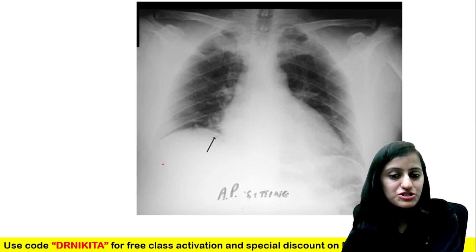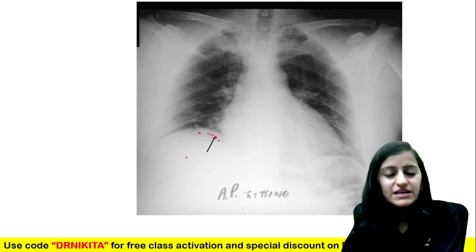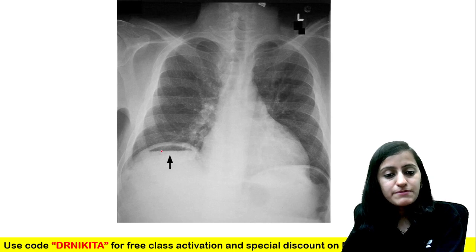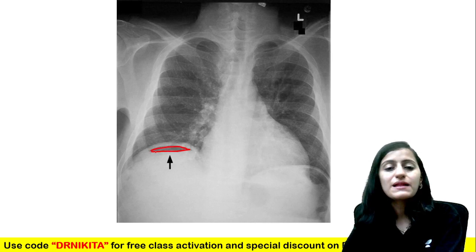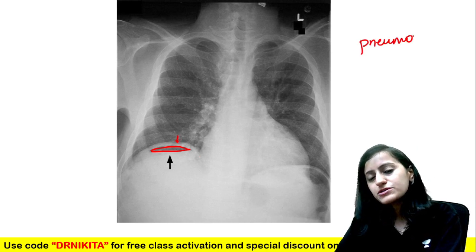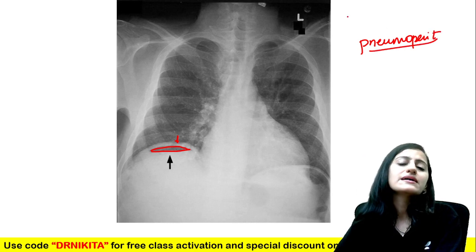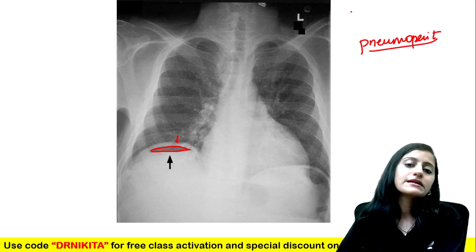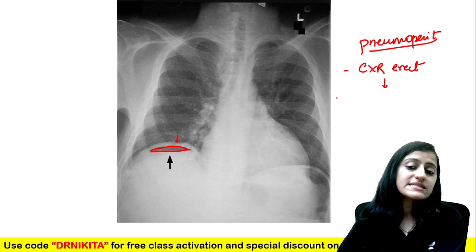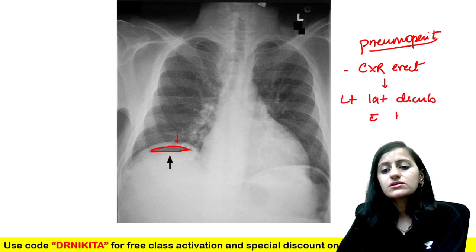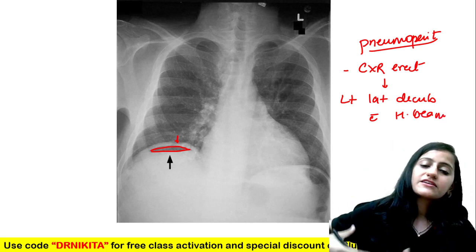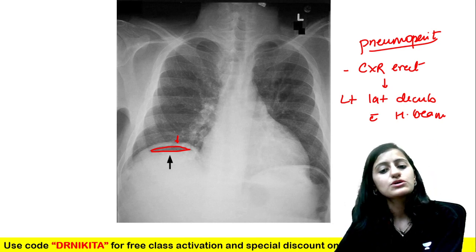In the same patient with pneumoperitoneum, we can see free air under the diaphragm — a very subtle but important finding to pick up. Sometimes pneumoperitoneum can be very obvious, with clearly visible free black air under the diaphragm. The best X-ray for detecting pneumoperitoneum is the chest X-ray erect. If the patient cannot stand erect, we do left lateral decubitus with a horizontal beam, so the air goes to the right side where the liver provides good contrast.